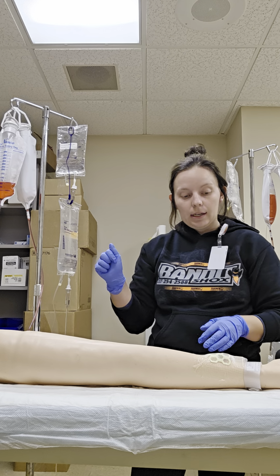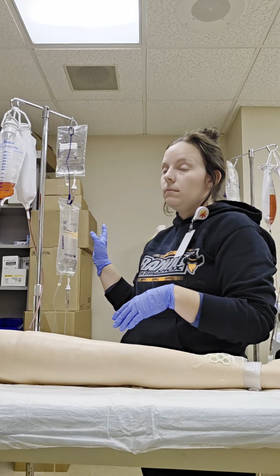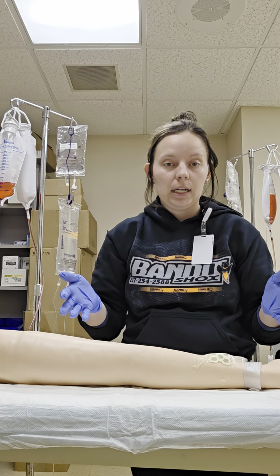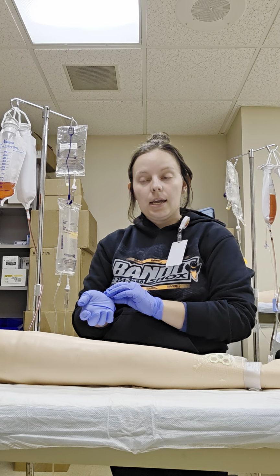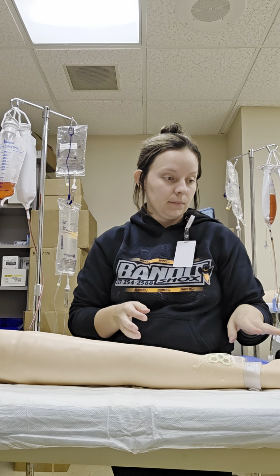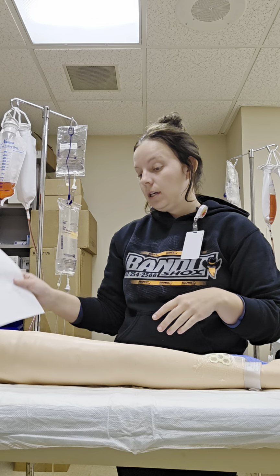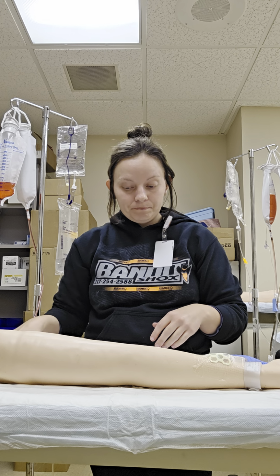So with that being said, while this is infusing, I would periodically come in here, check my infusion rate, assess Mr. Foley's IV, making sure that he's not infiltrated, inflamed, and making sure that Mr. Foley's not having any adverse reactions. And Mr. Foley looks good, so I'm going to go ahead and dispose of my gloves here, perform hand hygiene, make sure that Mr. Foley has no needs, his bed is low locked, side rails up, call light within reach. I'm going to go ahead and document on my MAR here. So documented on my MAR.